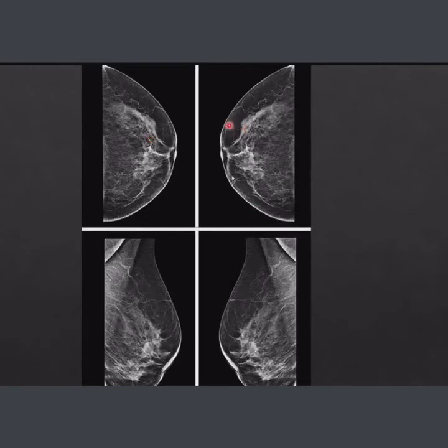The standard mammography views here are the craniocaudal (CC) and the mediolateral oblique (MLO). CC, craniocaudal, means the compression and the X-ray are from the superior to the inferior, so you get a superior-inferior view, almost like an axial view. This is the CC view, and this is the MLO, mediolateral oblique, almost like a lateral view. This is the normal breast.